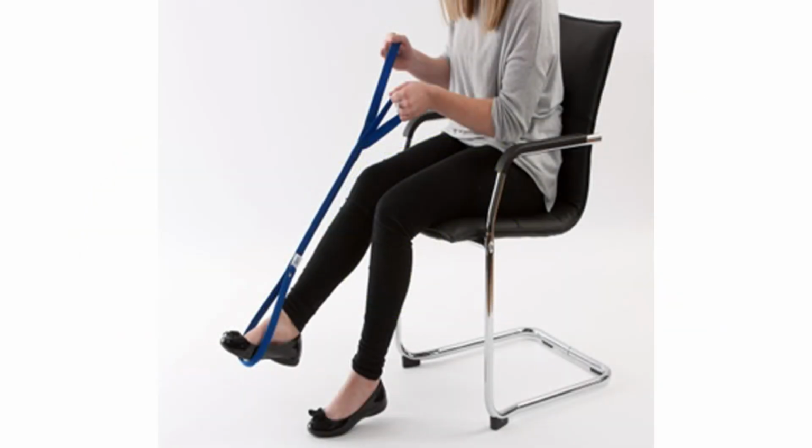The leg lifter is different from the other tools we've seen today. It is designed to help transfer individuals who have difficulty moving to a different location independently and safely. Examples would be getting into and out of a vehicle seat or classroom chair. The leg lifter has an adjustable hand loop with a comfortable grip and a foot loop so the foot stays secured during transfers. The strap is reinforced webbing with a rigid adjustable metal rod and loop design that effectively transfers students to and from various locations.